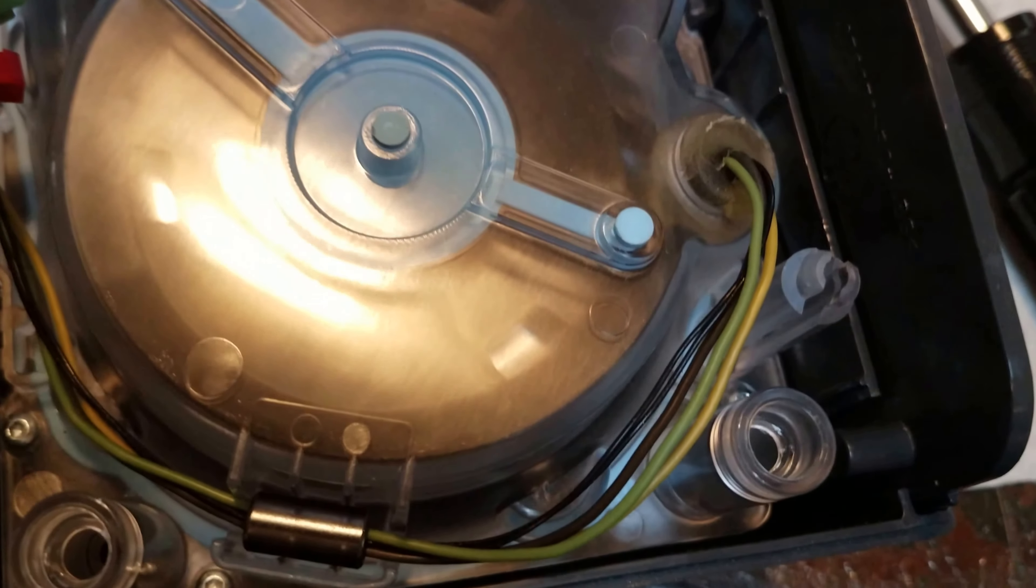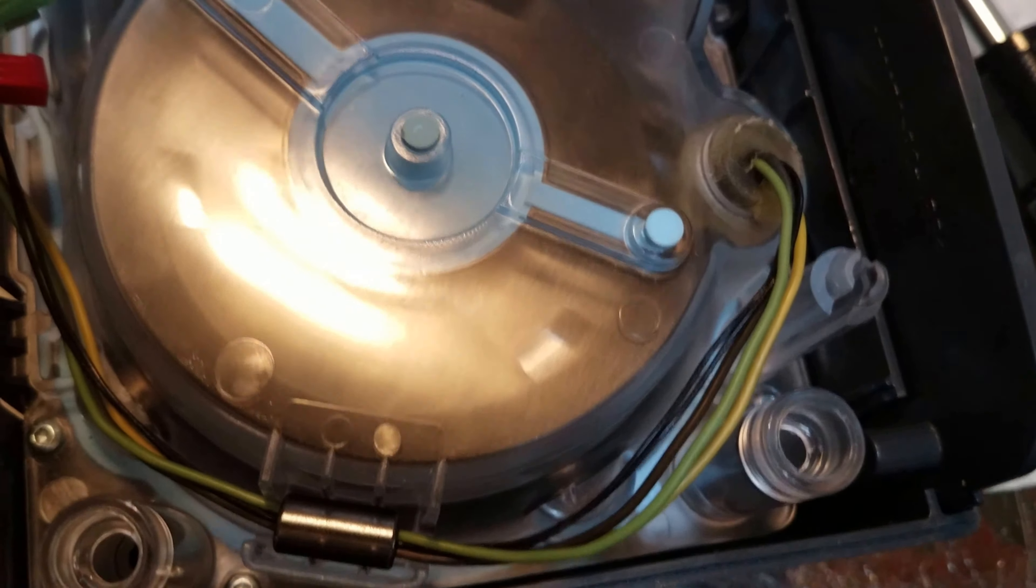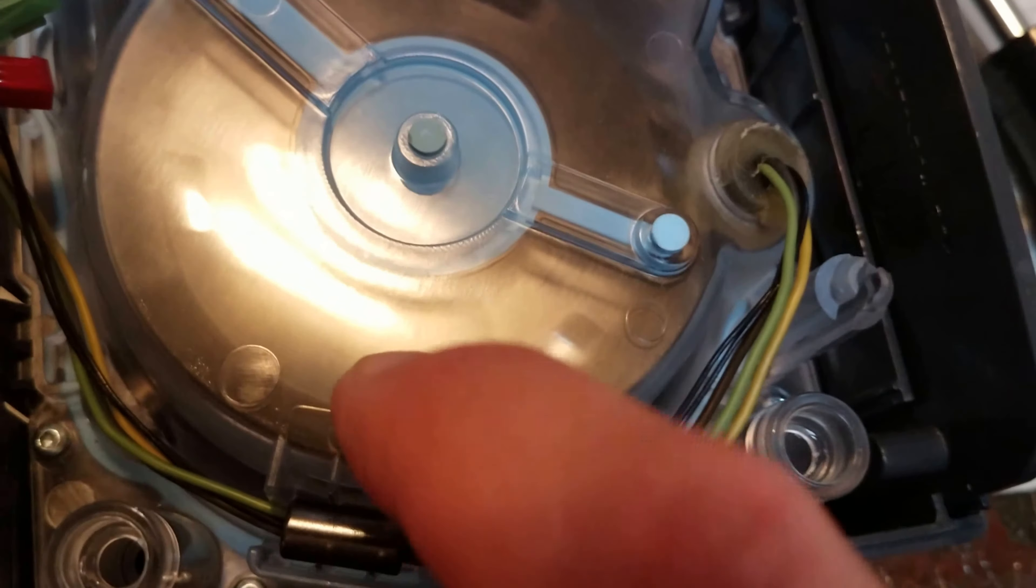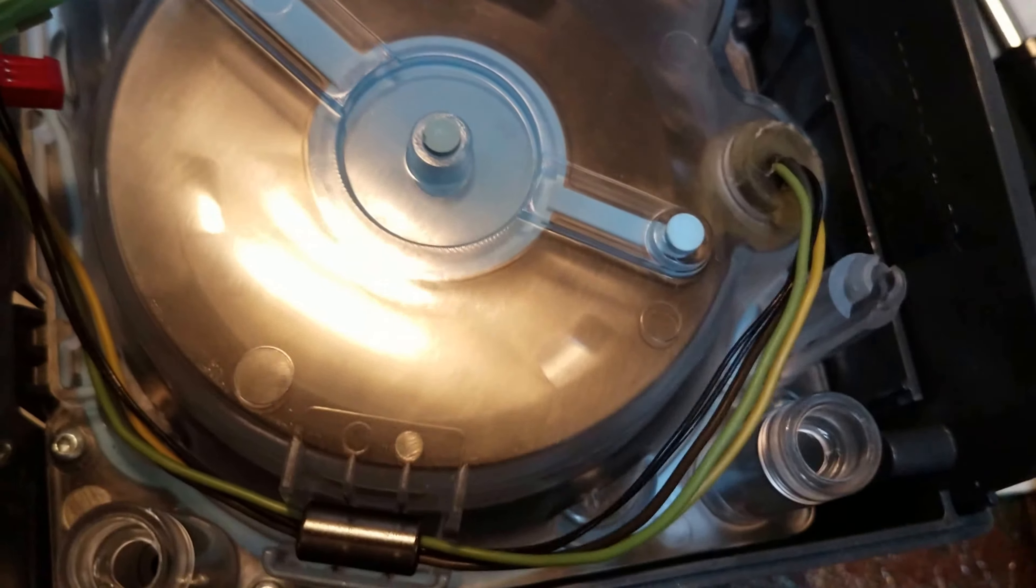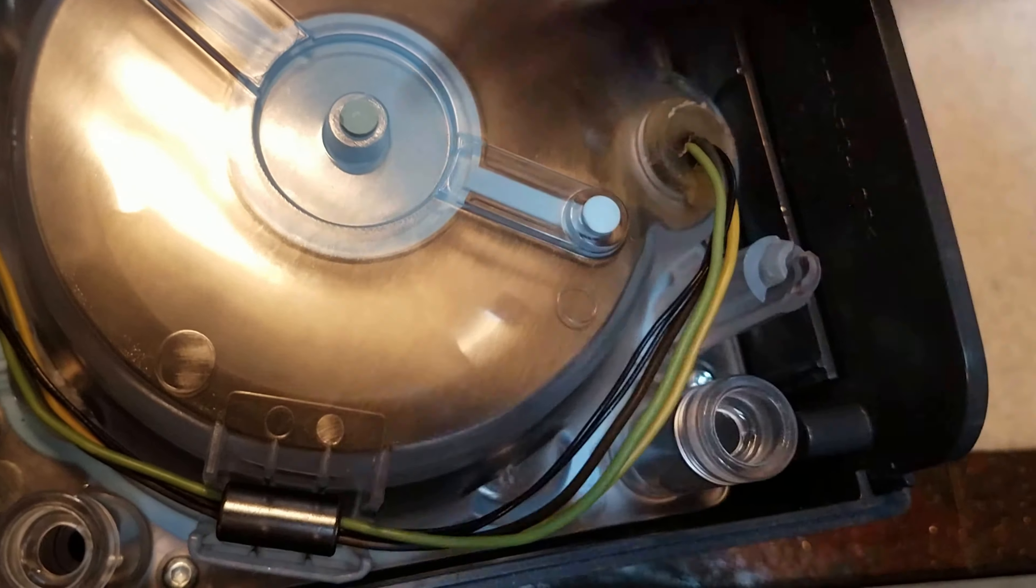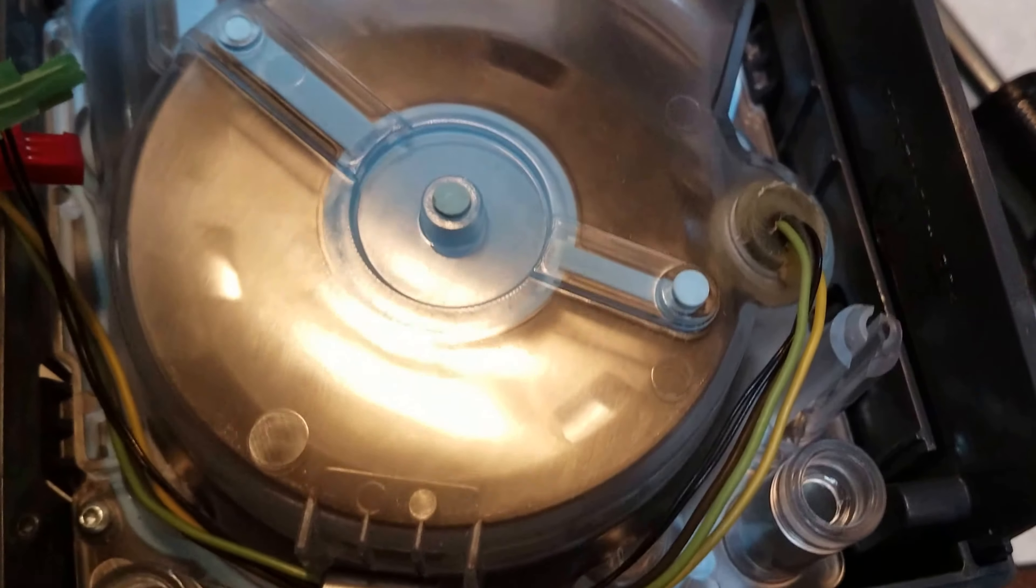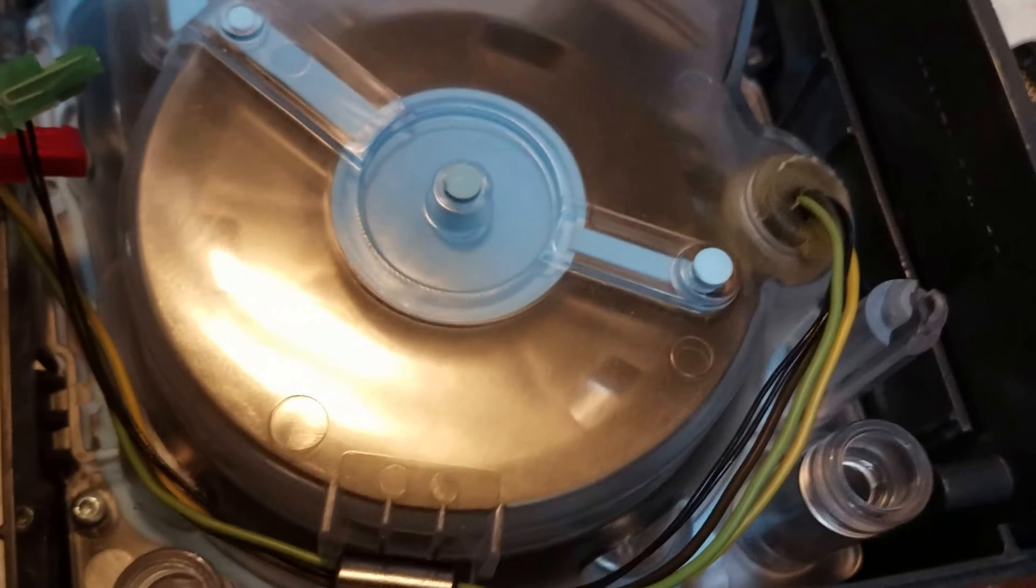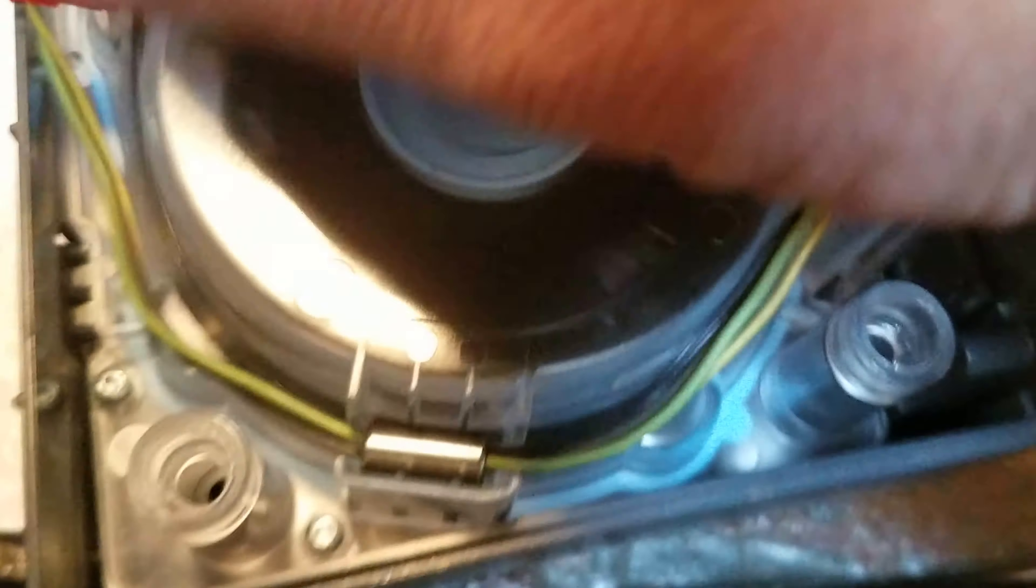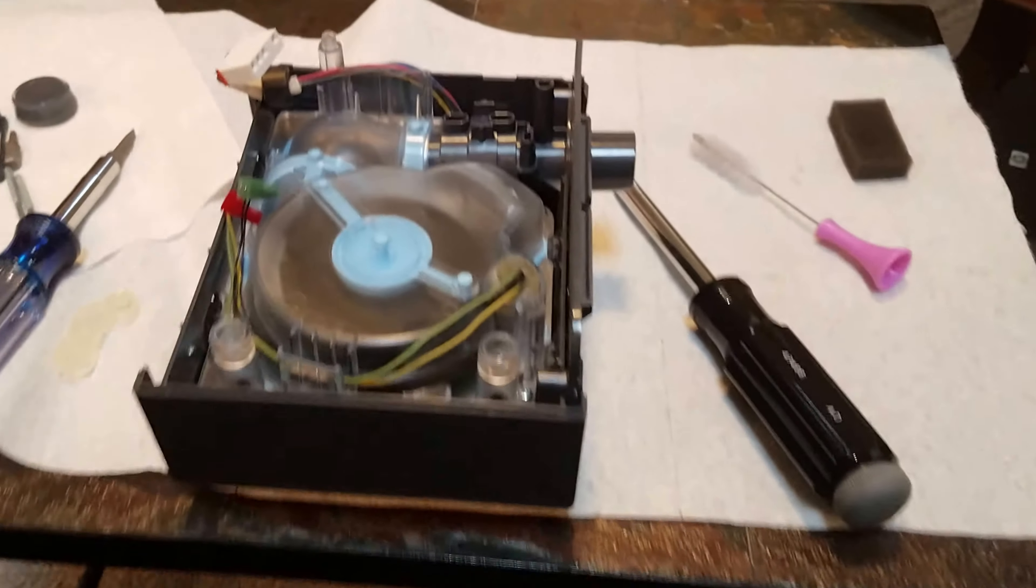Sorry the video ended too long-winded, but I taped that bit down just a little bit to hold it in place. It seemed that when I pulled it out originally it was a little firm in there, so I want to make sure that I replace it the same way.